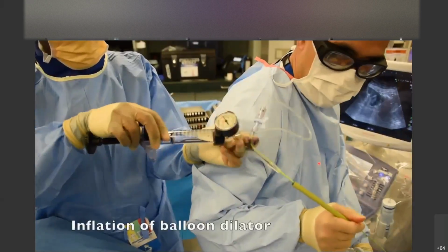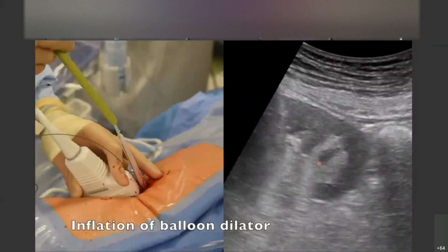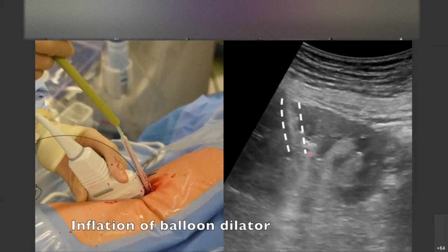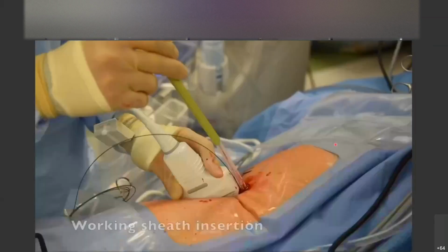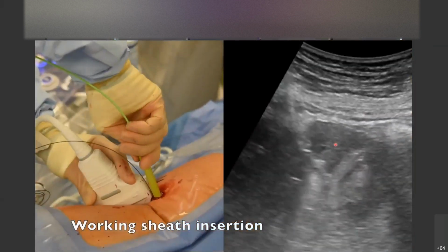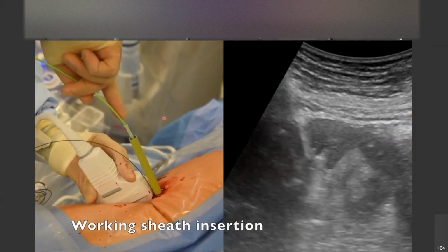What you can really appreciate is as the balloon is inflated, the saline inside or the contrast inside will become readily visible on the image. So here we can see the balloon dilating the parenchyma. One nice trick to make sure that you're not dilating too far is if you can move the wire in and out, you'll notice that it's not bent. That signifies that you're not somewhere you shouldn't be. The sheath and the balloon are the same length.